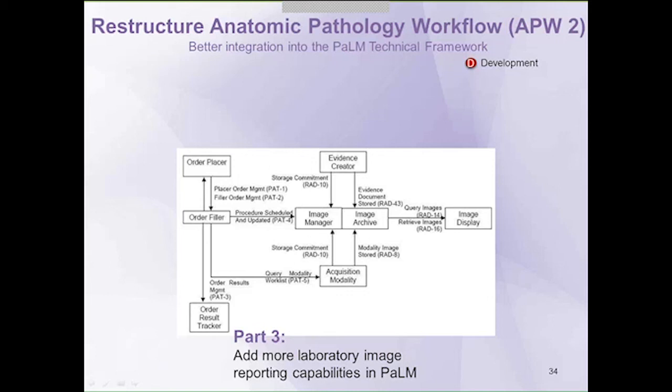And so there's significant thought that needs to go into a new profile that speaks to anatomic pathology workflow encompassing all sorts of images, because although the whole slide image is the future, it is the evolution of our specialty, there are many other images that are part of the pathology specialty that aren't part of radiology, such as the gross macroscopic exam images that are an integral part of rendering diagnoses for patients in the field of anatomic pathology.